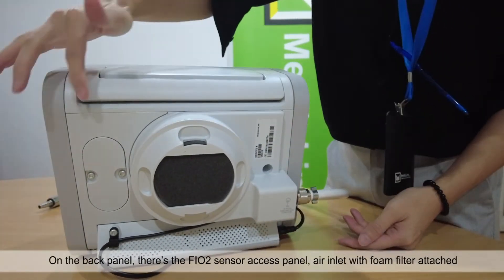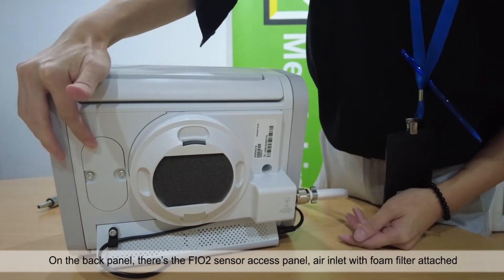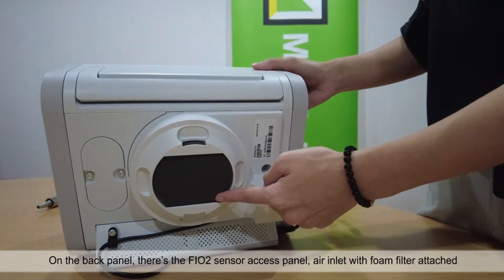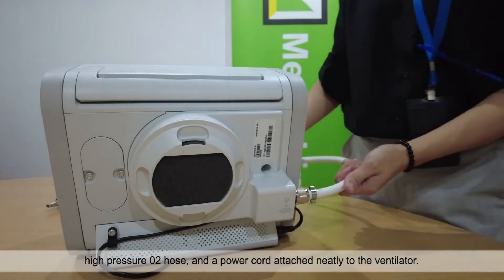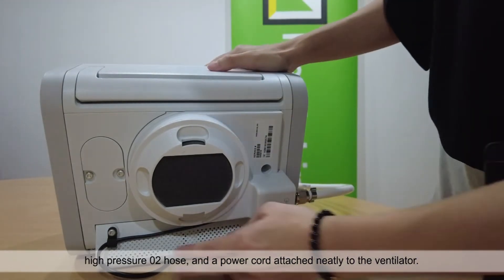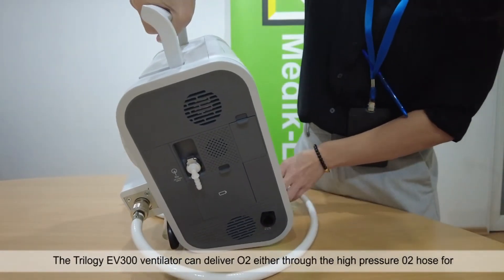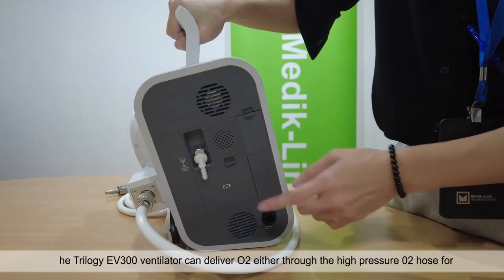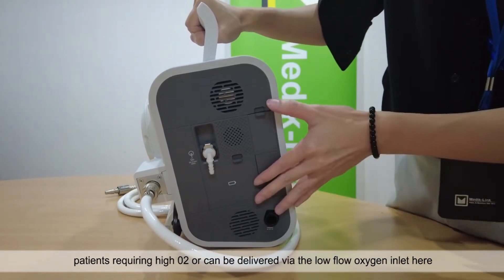On the back panel, there's the FiO2 sensor access panel, air inlet with foam filter attached. There is also a high pressure O2 hose and a power cord attached neatly to the ventilator. The Trilogy EV300 can deliver oxygen either through the high pressure O2 hose for patients requiring high O2, or via the low flow oxygen inlet.